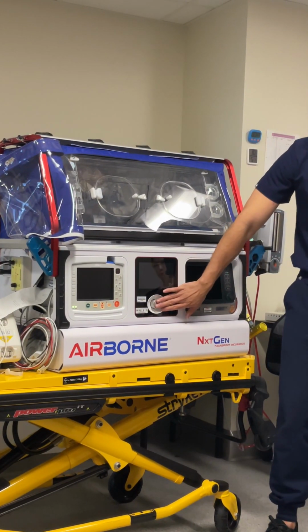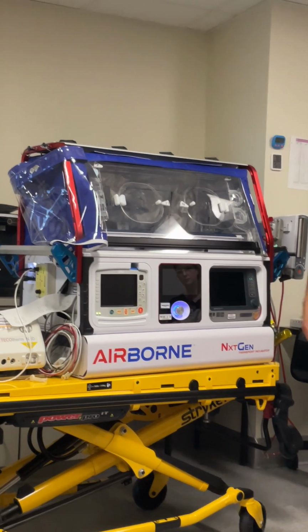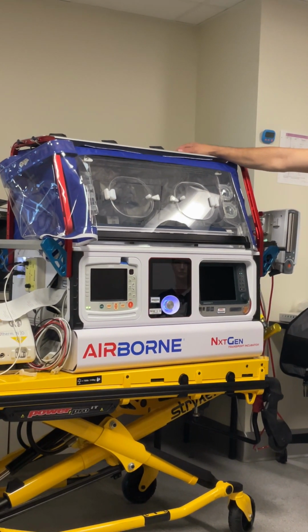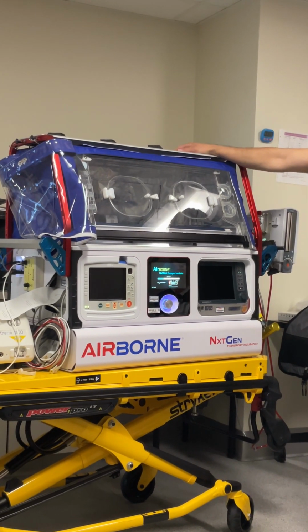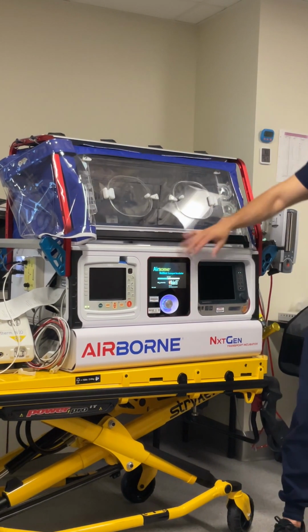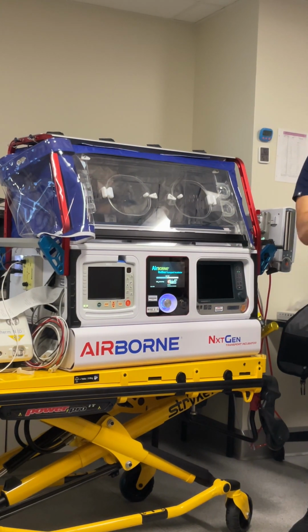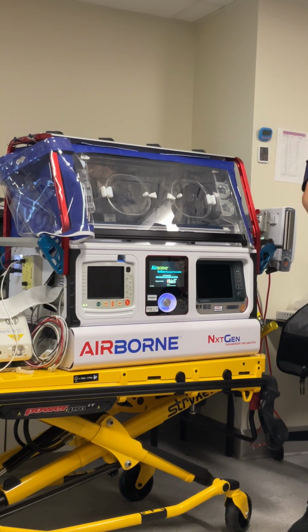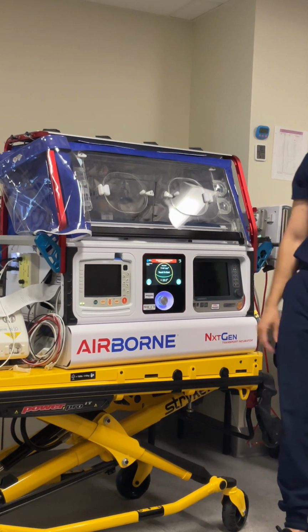So now we'll just go to the central monitor. Push on the center button, and it's going to go through its checks. Turn on. An important thing to remember when you have alarms, because it's going to happen, you can mute them, right? But if you mute it, it has to continue the chime. So some people get impatient and go, hey, I need this to stop now. Just press it once, see the X. It's just got to complete the chime.